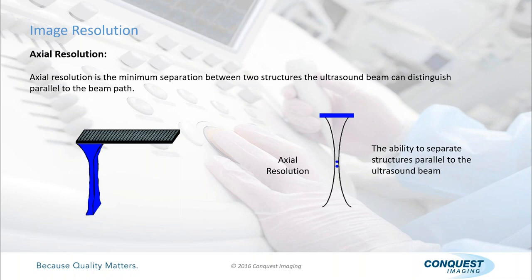But if we moved them, he's right, they become less clear. And what less clear means doesn't mean you can't see them. It means that they're going to become fuzzier. They're going to become bigger than they really are. They're not as defined. And when that happens, they'll blur together and look like one larger dot. Okay, so these two will no longer be able to see. Well, the same thing happens if you put them up here.